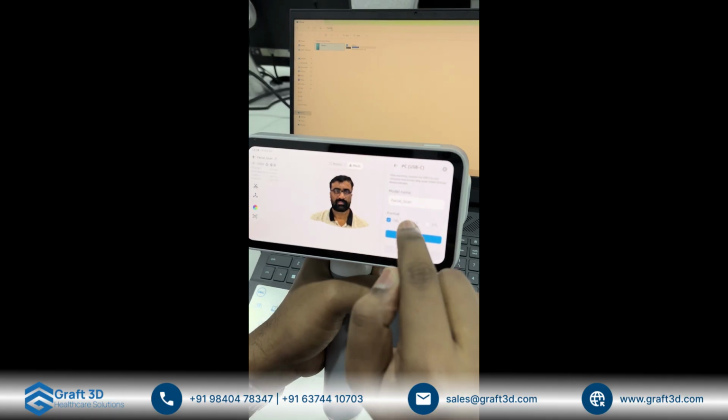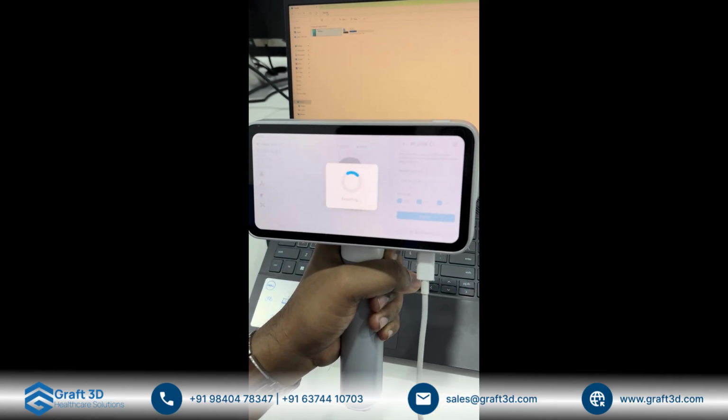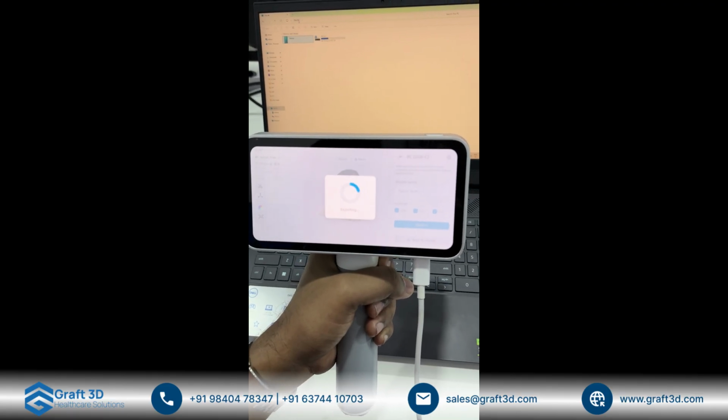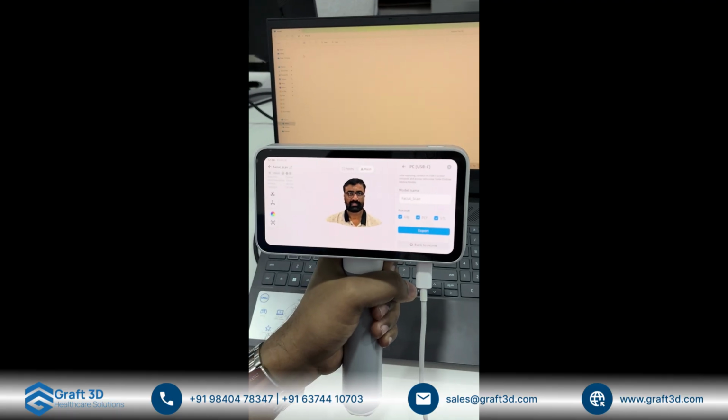We'll export it as OBJ, PLY, and STL. I'll export it. Okay, this is done. Now we'll go on the Medixa.